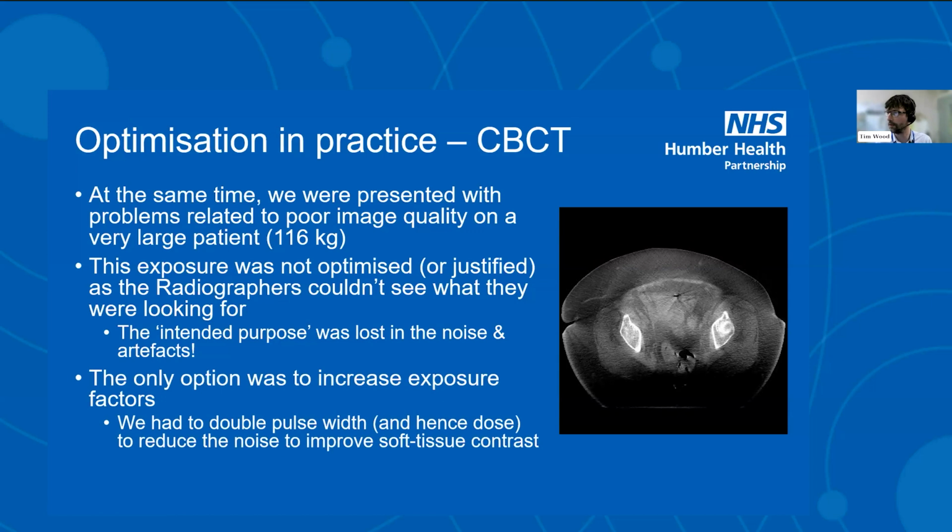Okay. But from this, we started to frame this idea, well, we have these slim patients, we don't need as much. We have these big patients where we need a bit more. And from that, we did a whole body of work and we came up with our own size-based modes. We deviated from that default setting for the vendor. We also introduced selection criteria to allow us to sort of guide us where we wanted to go.